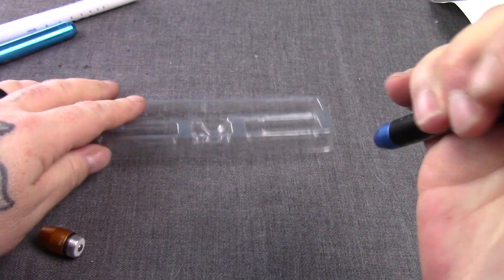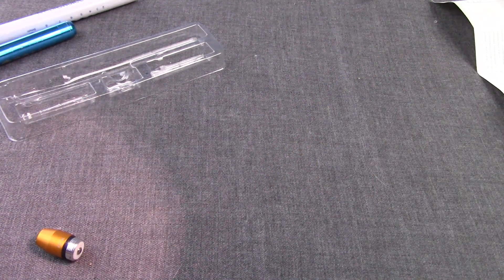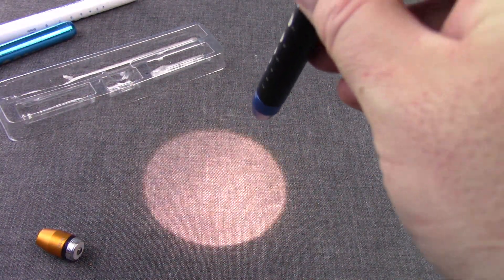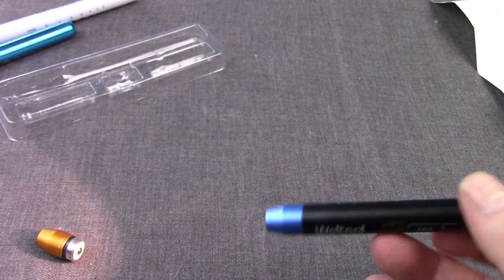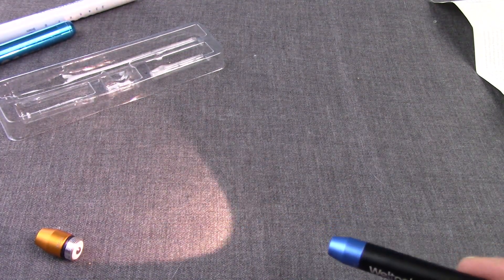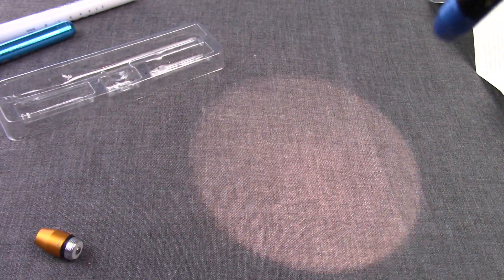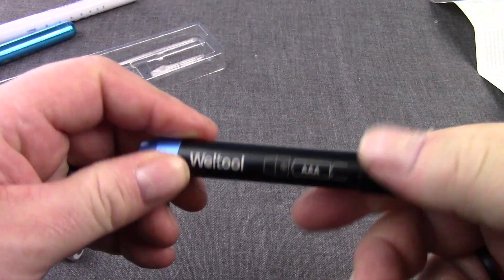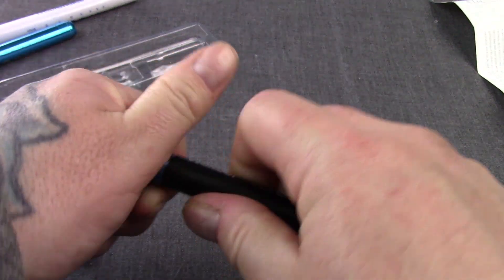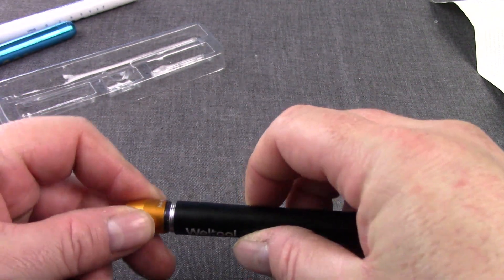To change the head, all you do is just unscrew it, pop the second head on, and you are good to go. You'll notice a very radically different beam profile. The LED has this beautiful beam pattern — just spot-on beautiful. This is a great multi-purpose light. The battery life is astronomical on it.